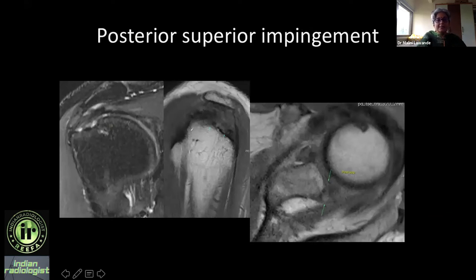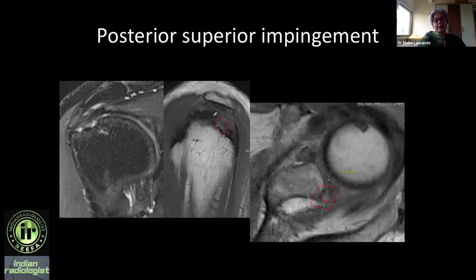Here I see a posterior superior labral tear clearly, with a small incipient paralabral cyst which can enlarge and sometimes cause compression of the suprascapular nerve branches. I also see a posterior supraspinatus and anterior infraspinatus undersurface tear.